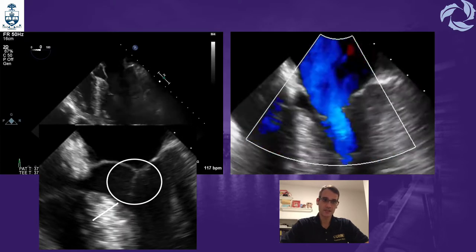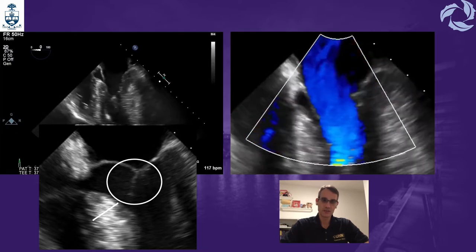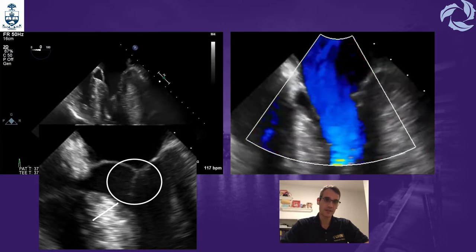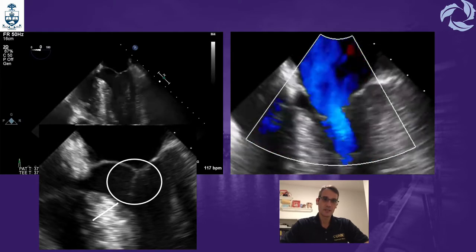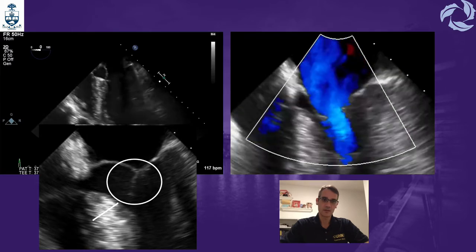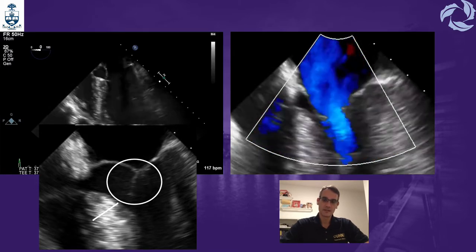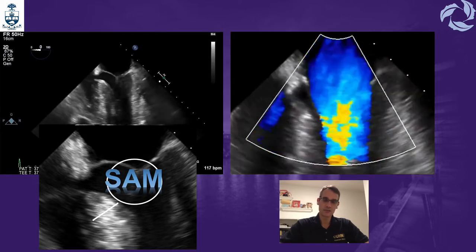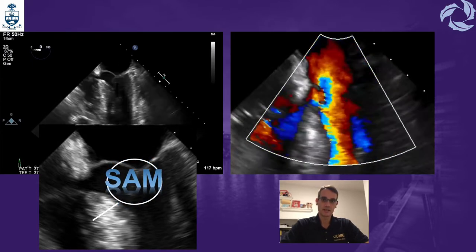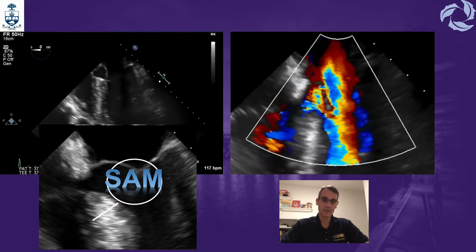Pay close attention to this image. We can see that the patient has a very thick ventricle, and the septum is enlarged — anything more than 1.1 cm is considered hypertrophied. During systole, you can see the anterior mitral valve leaflet occupying the LVOT tract. When that happens, this is considered SAM, and in that situation it can cause a lot of hemodynamic instability.